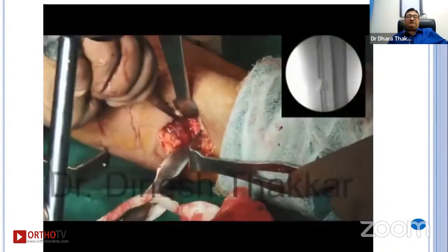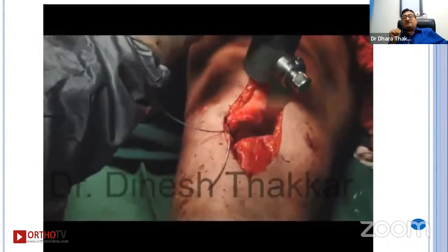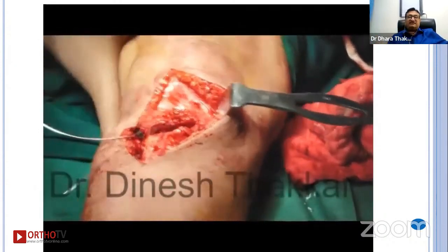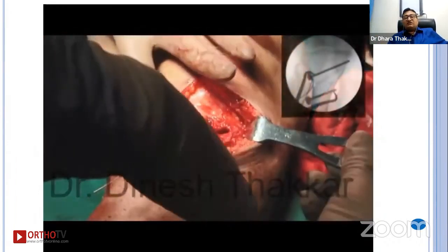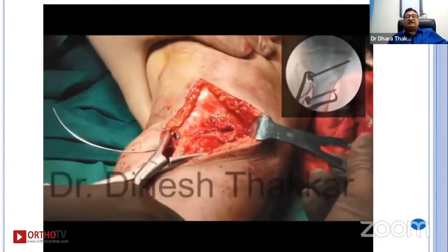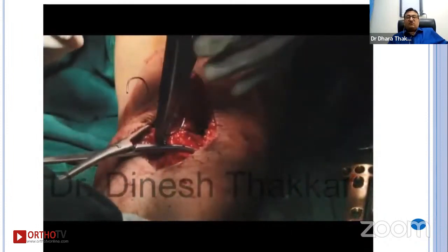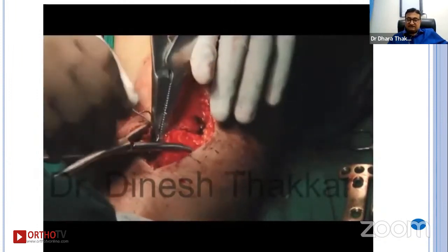Then an osteotomy of a segment of the fibula is done, like this. And then I cut only the distal cortex of the osteotomy. I keep the proximal posterior cortex intact, and then I slide the distal tibia over the proximal posterior cortex. After closing the osteotomy, I hold it with this pointed clamp, and then I tighten the stainless steel wire between one proximal and one distal screw on the lateral cortex. This is how the SS wire is being tightened. Now it will become a very stable osteotomy after tightening this stainless steel wire.